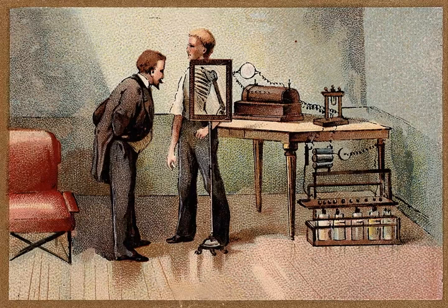The anode target, or focal spot, is an area of the anode struck by the electrons from the cathode. The stator consists of induction motor electromagnets that make the rotor turn. The rotor is the rotating member that spins the anode, and is typically made of copper. A cathode serves to expel the electrons from the circuit and focus them in a beam that travels to the focal spot of the anode.